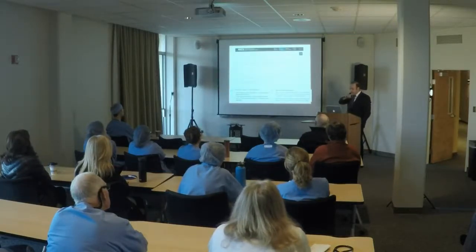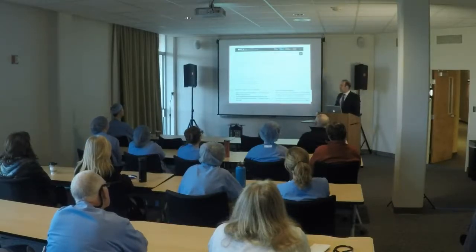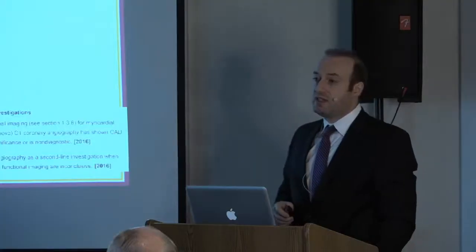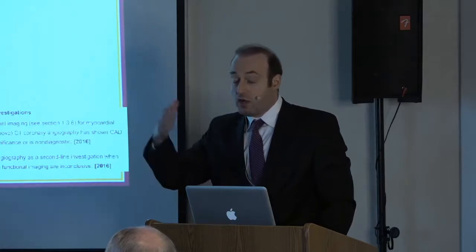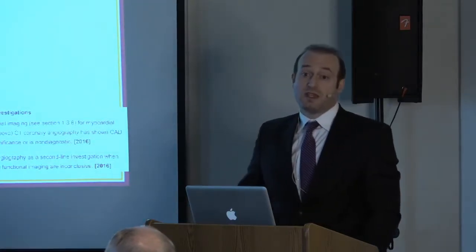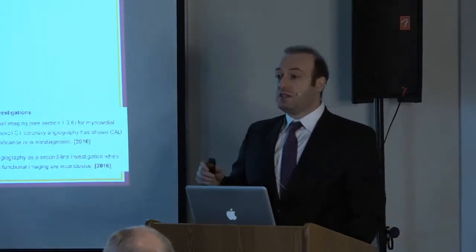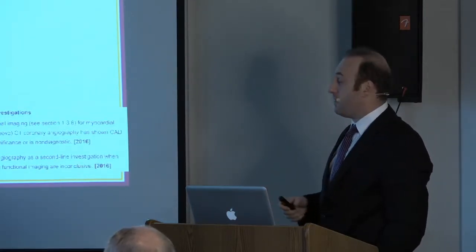And that brings us to the recent NICE guidelines from the UK, the National Institute of Health and Care Excellence, that in 2016 performed a rigorous evidence-based evaluation of the totality of the data, looking at all the non-invasive stress tests out there, CTA, and made a bold statement saying that in patients with new onset chest pain, CT should be the first-line diagnostic strategy for chest pain evaluation.